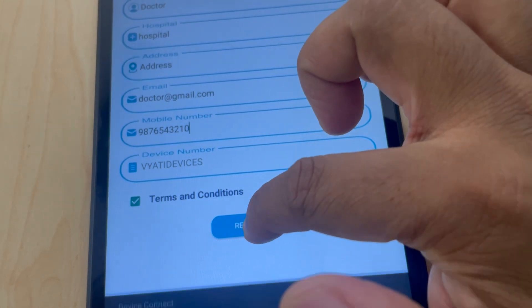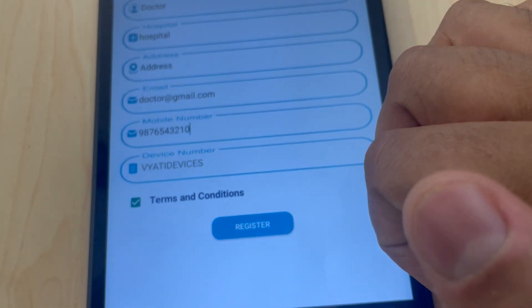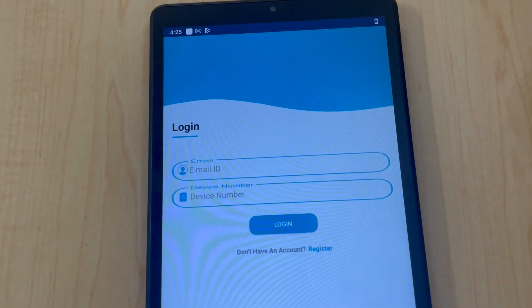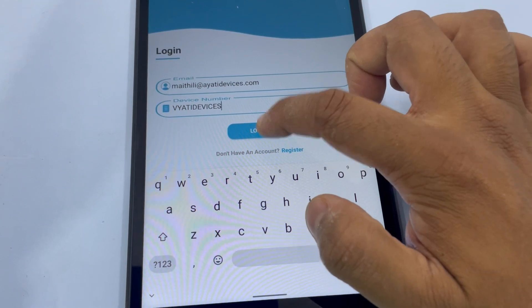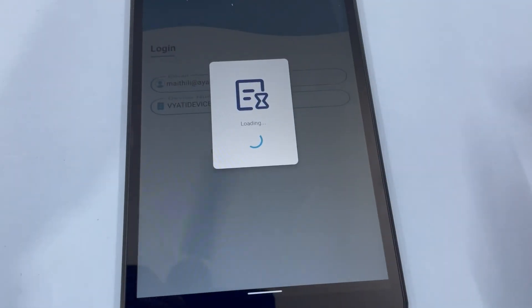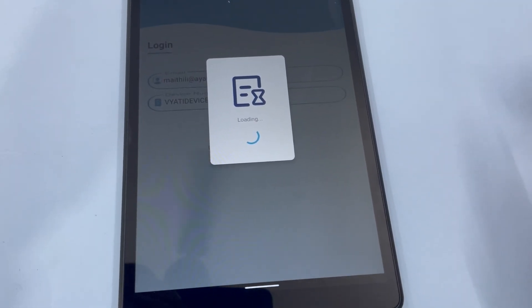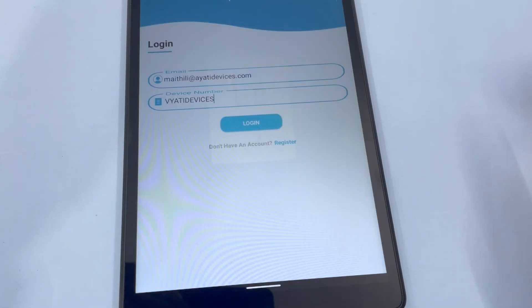Once registration is successful, log in by entering your registered email address and the device serial number. This will take you to the app dashboard.